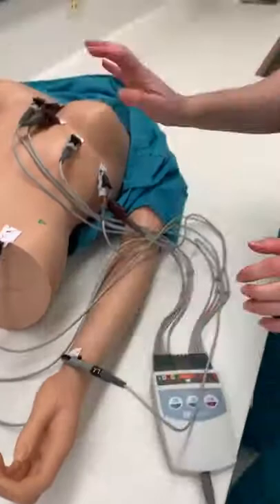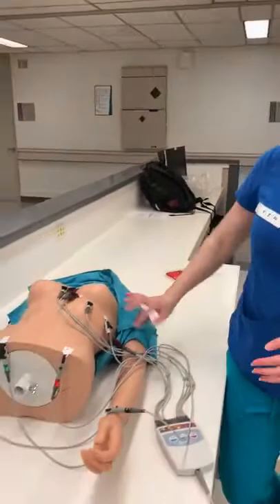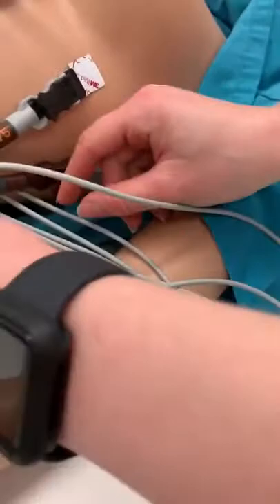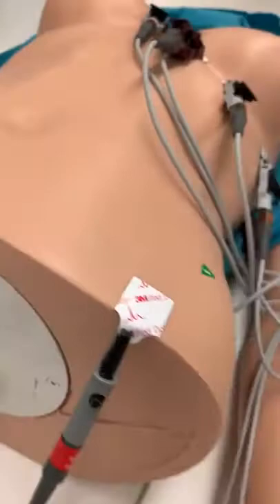Prior to placing any of the leads on your patient, you want to make sure that their skin is clean and dry. If they have hair, you need to shave it — you have to have good contact of your electrode pads with the patient's skin or else you will not get a good tracing. Once we've attached everything, we're going to ask her to hold nice and still and double check that all our leads are sitting flat. You see how V6 here is kind of flared out? We want to reposition that so it's nice and flat — otherwise we won't get a good tracing. You just have to MacGyver your wires a little bit and make everything look nice and flat.